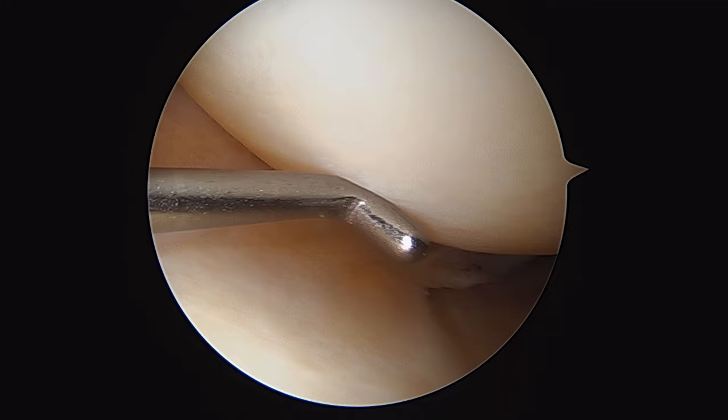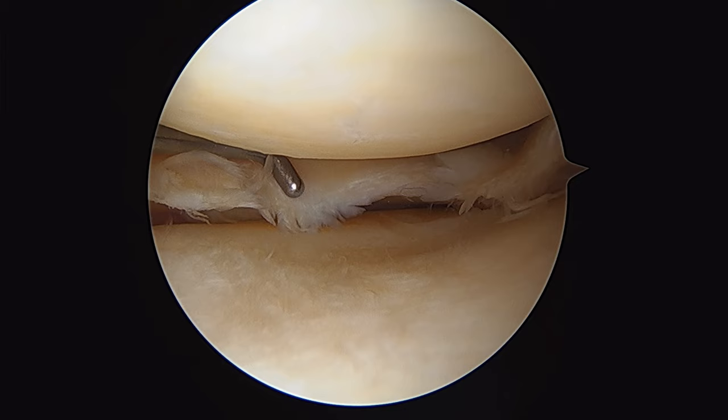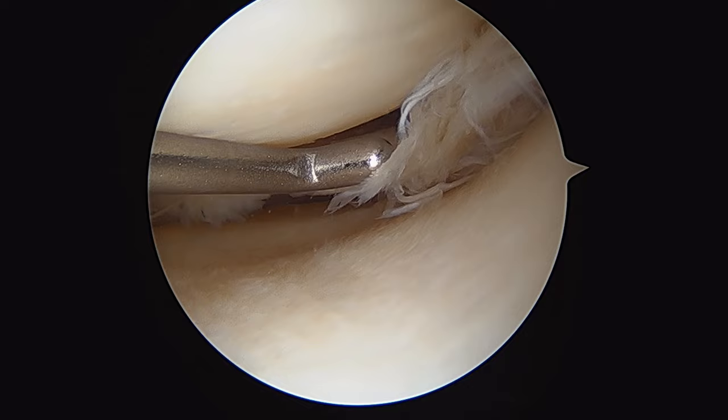This is the medial femoral condyle here, and below us is the medial tibial plateau. This is the anterior horn of the medial meniscus, which extends around into the body of the medial meniscus here, which you can see is torn.